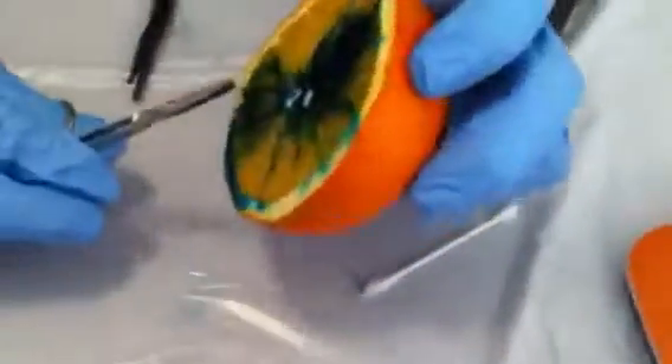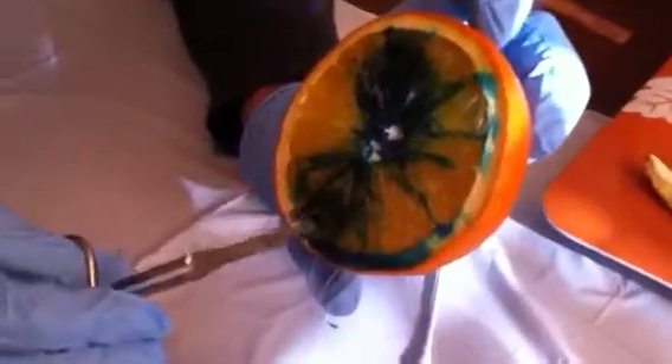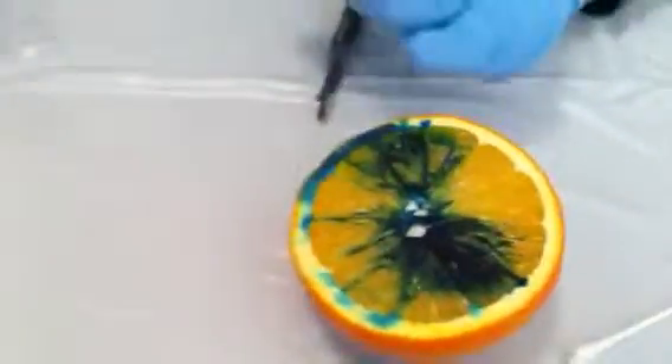You can look at this now — that's how it looked like before. If you can see here I marked two spots. Now it looks a little better here and I don't want to do this area anymore because I don't want to cut the viable tissue. So this would conclude our sharp debridement part. Thank you.